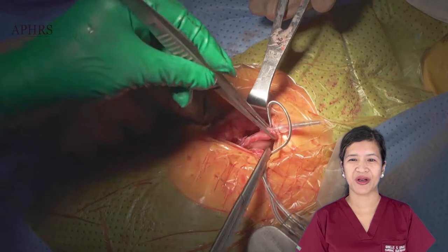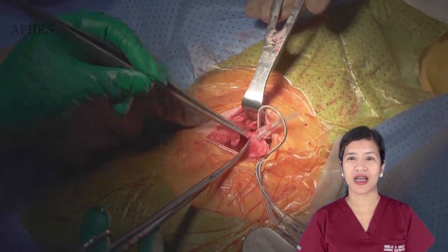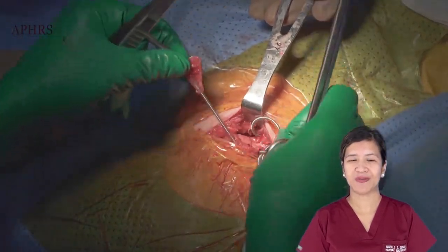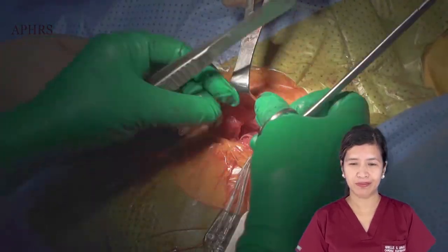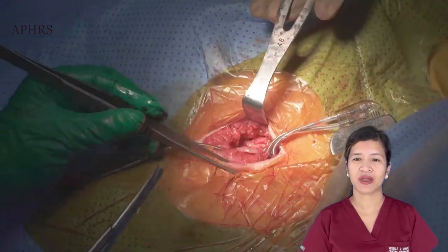It is quite challenging in this particular pocket, and effort must be exercised to define the plane of the pectoralis fascia, which can be very difficult. There is even an abandoned lead here which we take out of the pocket, trim excess tissue from, and pull through as such.